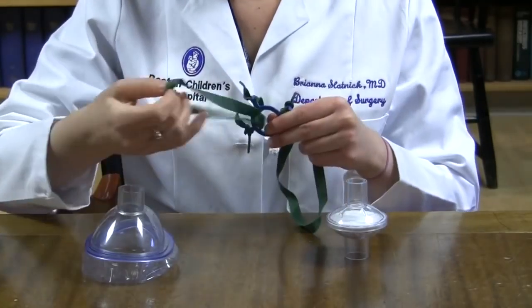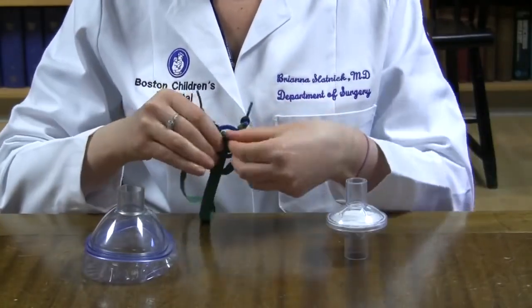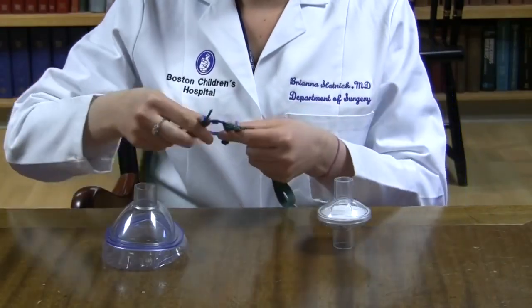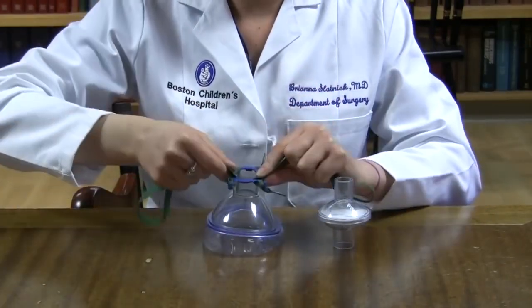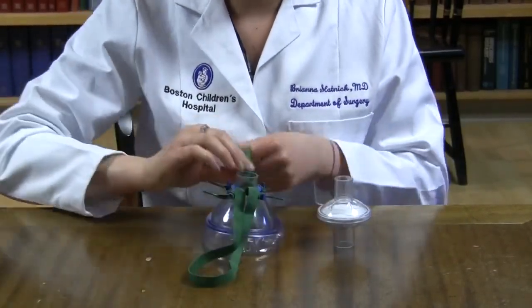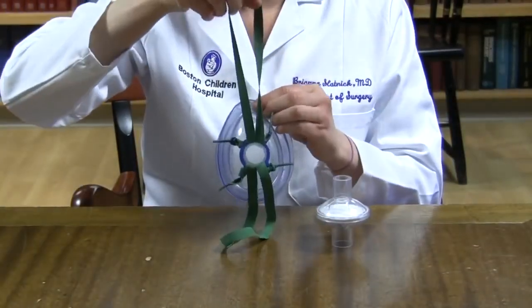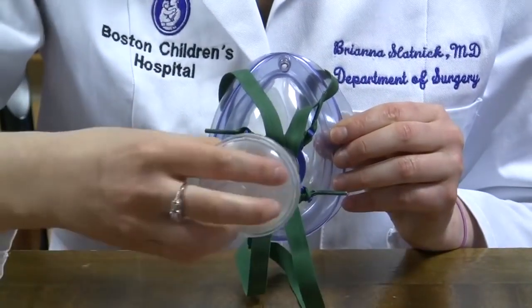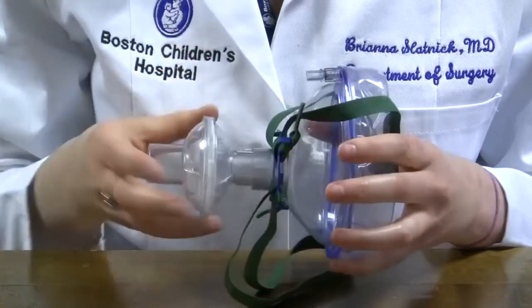Tuck each strap into the middle of the ring and pull through to secure. Now place the ring back onto your mask. Orient the ring such that one strap is on the top and one on the bottom. Now attach the small end of your filter to the open end of the mask and secure it tightly.